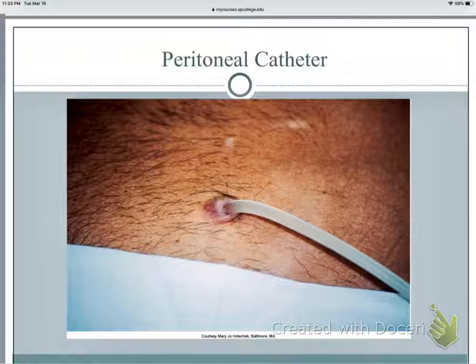And that prevents the travel of microorganisms into the peritoneum. It takes time for the catheter to settle into the tissue. It can take a few weeks. Fibrous tissue grows around it, and then it sets itself. The tip of the catheter rests in the peritoneal cavity, and it also has a lot of perforations, and that's how the catheter works. All those little holes in the catheter allow the fluid to go out and in.